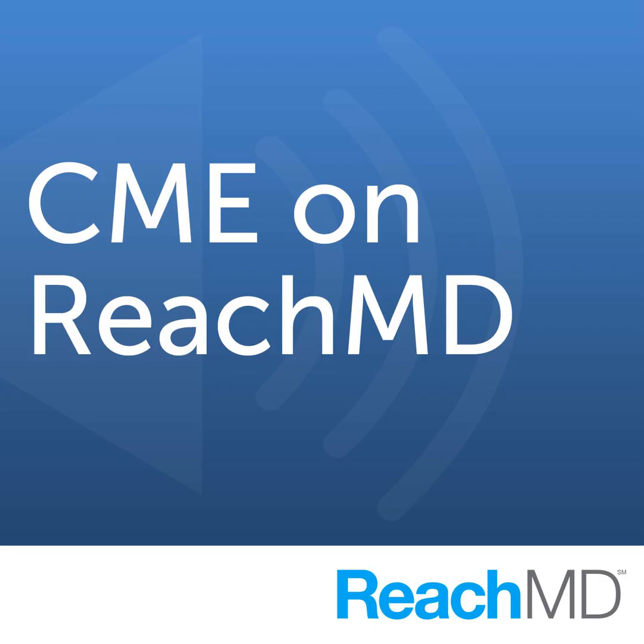We need to think about outflow tract obstruction, but we need to be proactive in assessing it. We need to do the provocation maneuvers at the time of their echocardiography. And we need to be proactive also about genetic testing, which is frequently not performed in clinical practice. We need to rule out phenocopies. We're going to hear much more about how we can do that with imaging, in particular cardiac MRI.